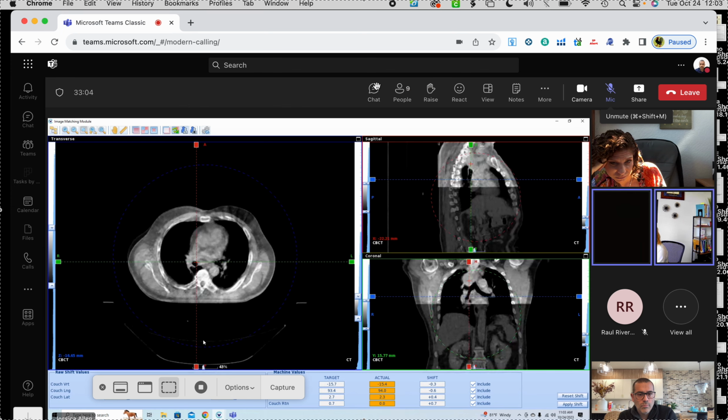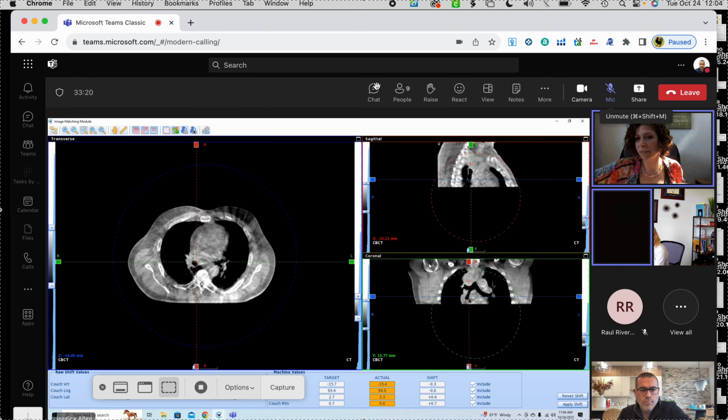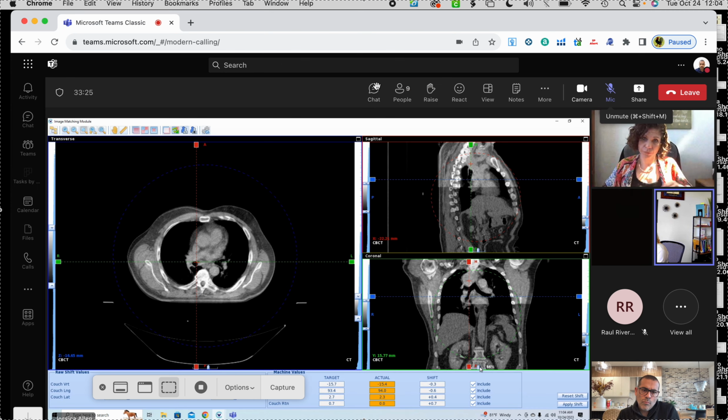I heard somebody say that it's the arms. So take a look at the original. Do we see the arm placement? And what are those called? Humeral heads. All right, so look at them there. What's happening here? And today you're a little lower.